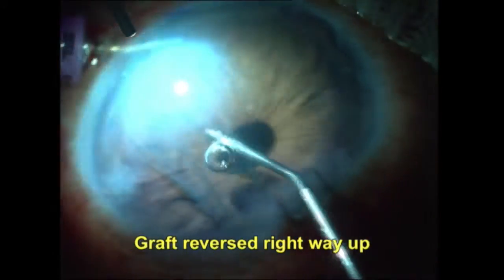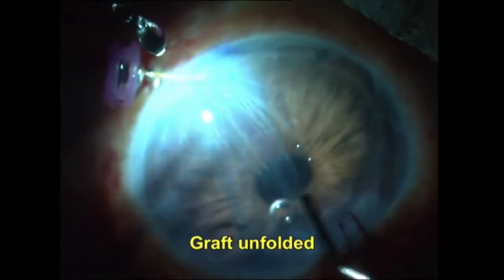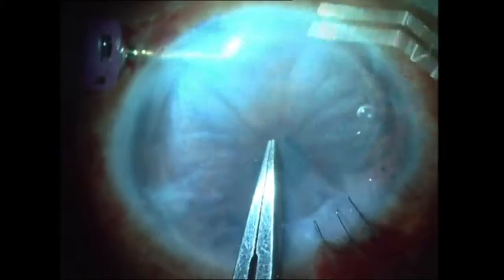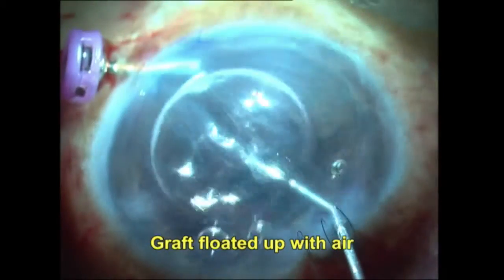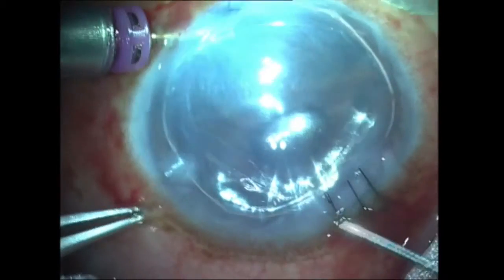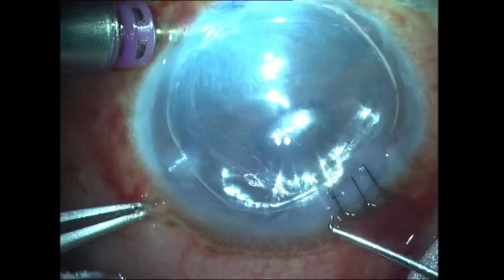Now what happens, as I said earlier, in the younger grafts or in many DMEC grafts is that you're able to unfold it to a large extent, but sometimes those very extreme peripheral edge folds create trouble for you. You may not be able to unfold it all the way, especially if you're working with a younger donor. So what you can do is once you have unfolded it to quite a large extent, you can put in that air bubble, and you can see now I again go in with my technique of air pump assisted PDEC, and I've got air starting to flow into the anterior chamber again.